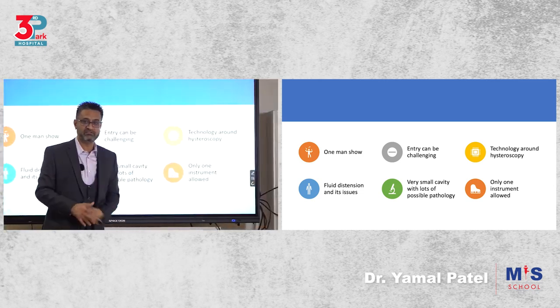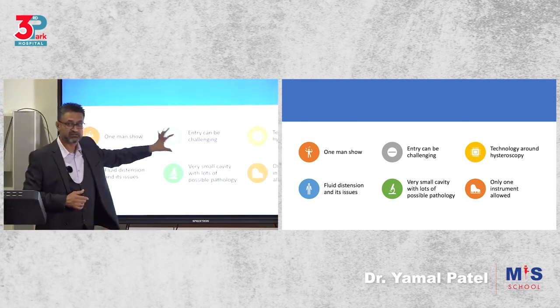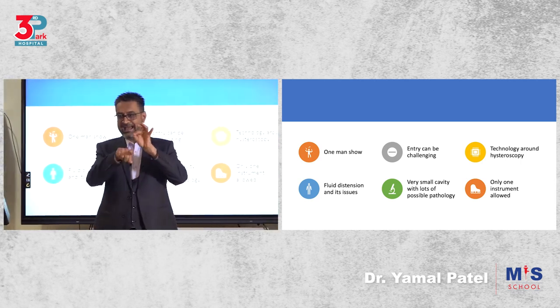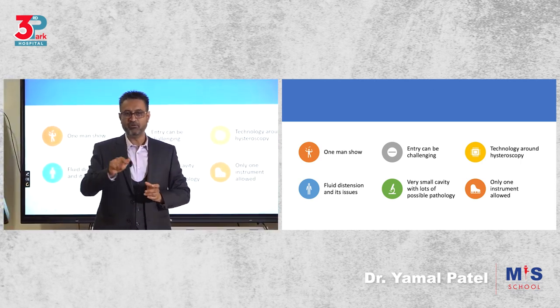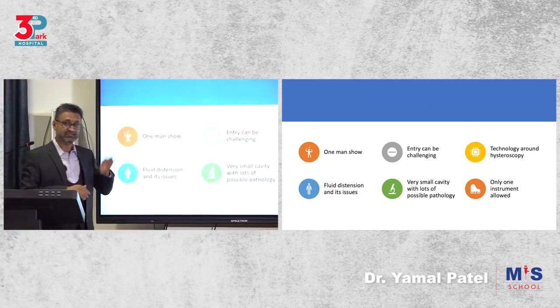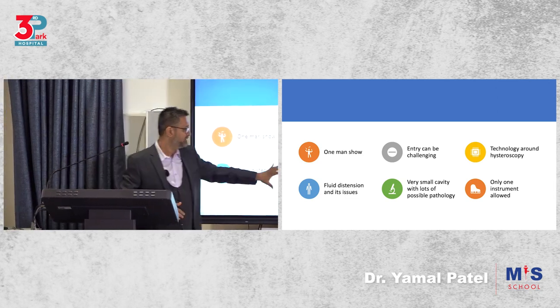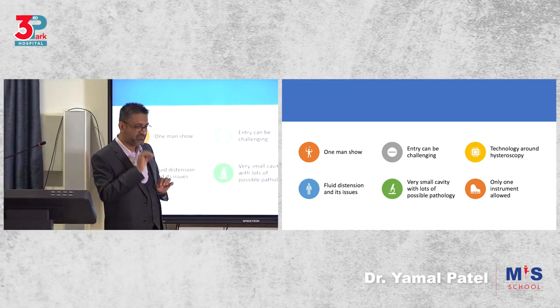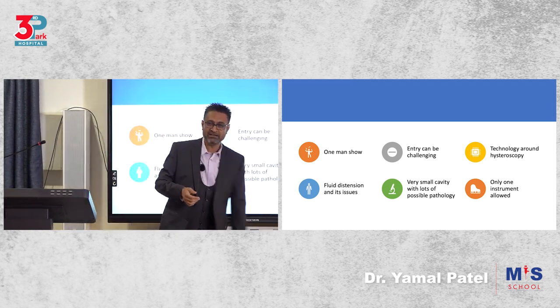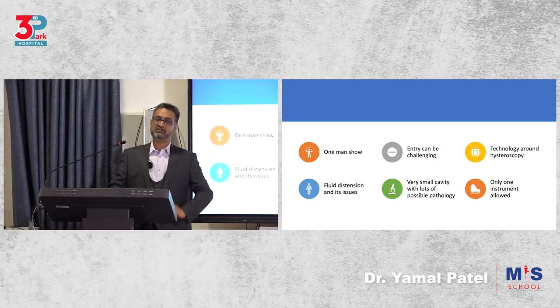You need to know the technology around hysteroscopy. Ideally speaking, this should be taught vaginoscopic. I only do vaginoscopic. I never hold, dilate, and go in with the hysteroscope. We go in direct with the vaginoscopic entry. You need to know fluid, its distension mechanisms, and its issues of overload. You need to know you're working with a very small cavity with lots of possible pathology, and only one instrument is operating at any given time. So these are issues you need to learn about hysteroscopy.